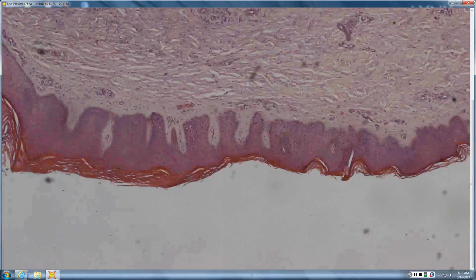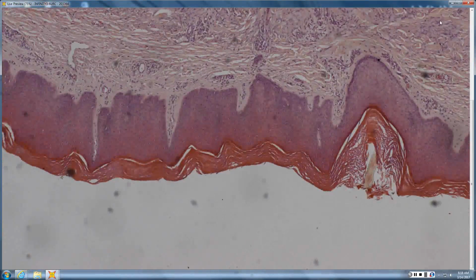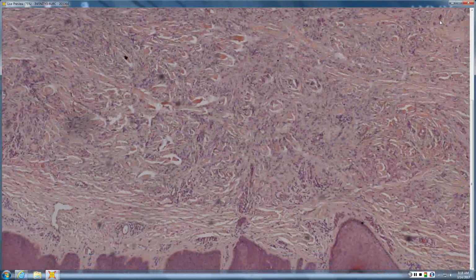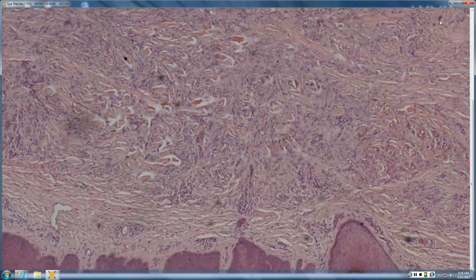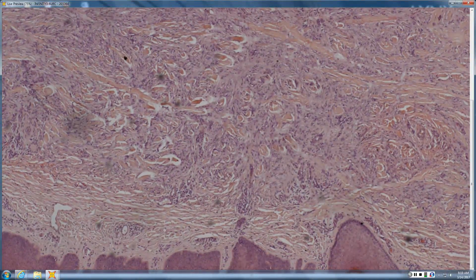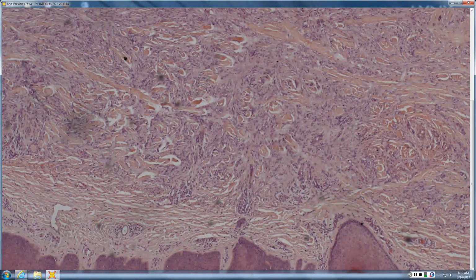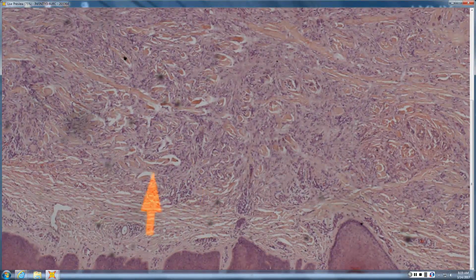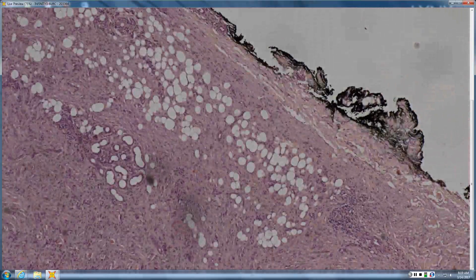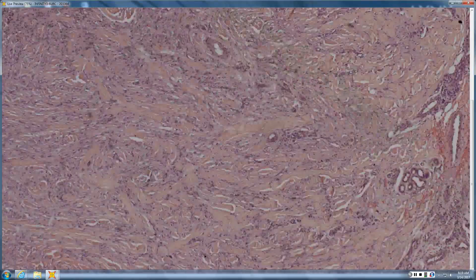Okay, David, take the easy way out. Okay, well, with that, let's see, we have an acanthotic epidermis. A big acanthotic epidermis. What kind of fibrous tumors do that? Dermatofibroma. So I would ask myself then, could this be any kind of dermatofibroma? Does it have features of a dermatofibroma? Yeah, I see some collagen trapping. So you see collagen balls, collagen trapping, and it's lacy into the fat. That's okay in a DF.